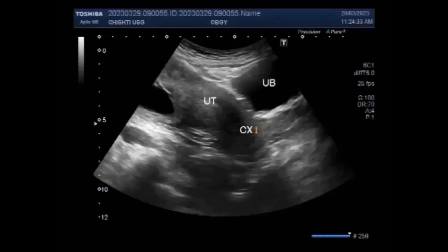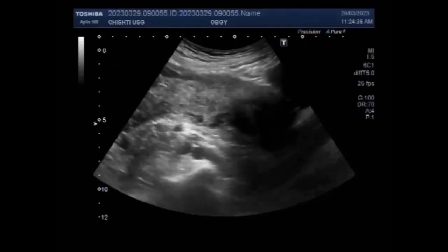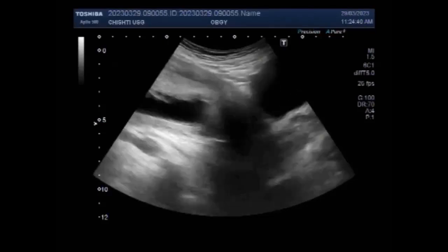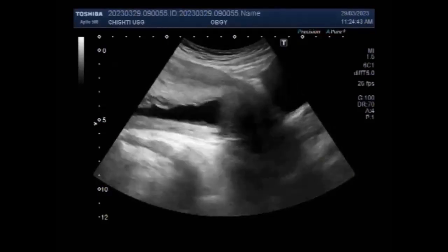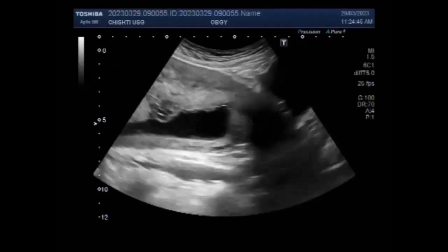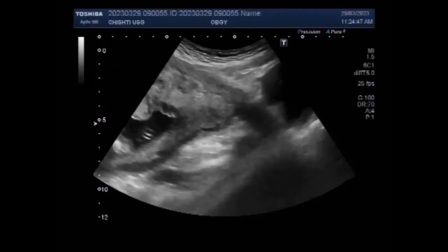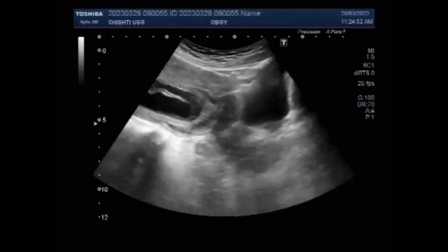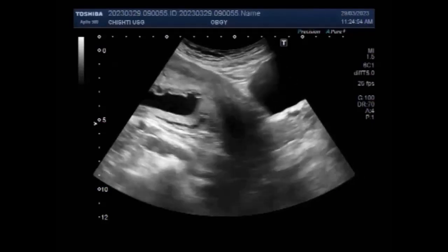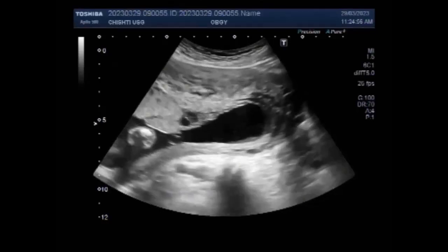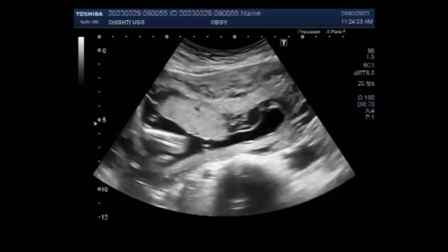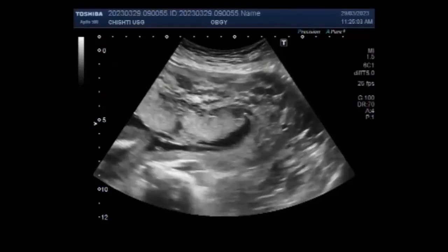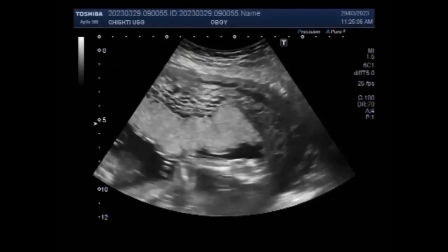Complete moles are associated with the absence of a fetus. Partial moles usually occur with an abnormal fetus or may even be associated with fetal demise. But in this case, partial hydatidiform mole is seen along with a normal, viable, alive, active fetus of about 21 weeks.